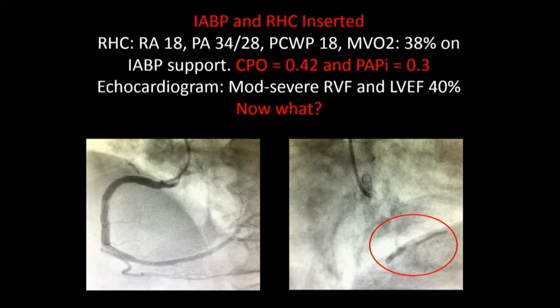Can you aspirate those clots? So you can see the angiogram on the left, that's the residual and the post, so there's still certainly could be more work to be done. This is 18 hours post-presentation, so the likelihood of getting a fresh clot out is starting to become more diminished. It looks like they've jailed off all the RV marginals from that RCA, which I think really this is predominantly right-sided. Yeah, so this is a really critical point that once you lose those marginals, that's when you start to develop RV free wall dysfunction.